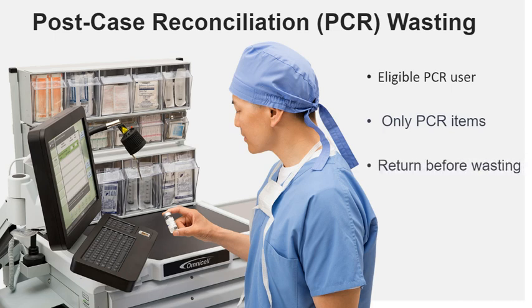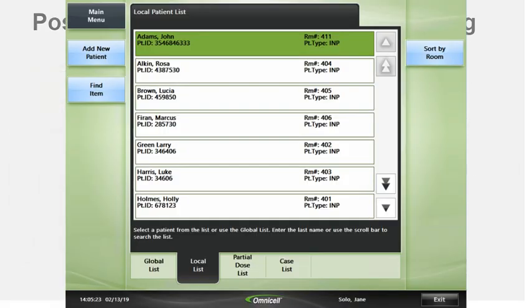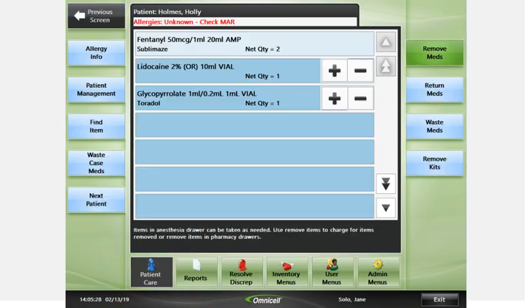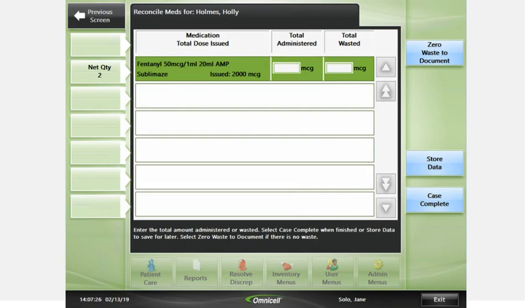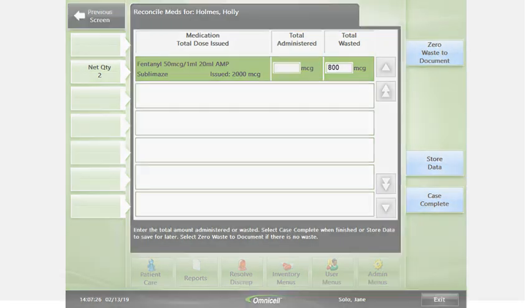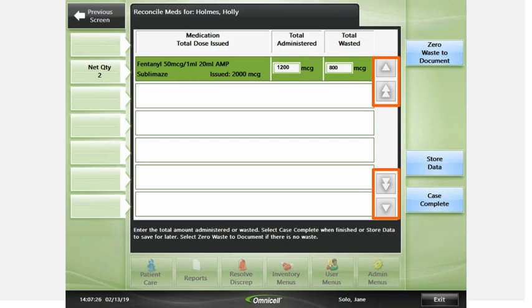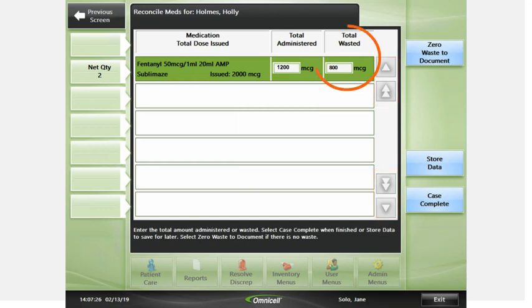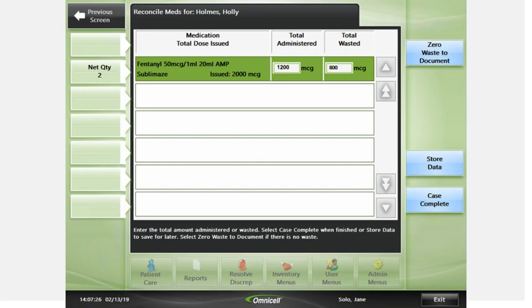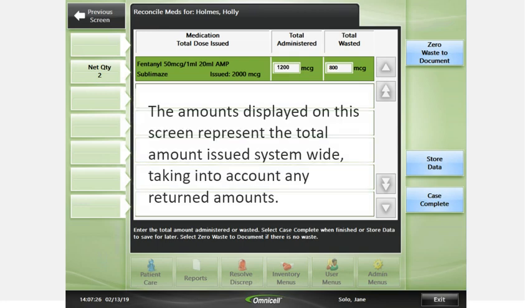Always return items before you perform a waste. From patient care, select the patient and press Waste Case Meds. From the post-case reconciliation screen, enter the total amount administered or wasted. Press the up-down arrows or the tab key on the keyboard to advance quickly through the list. The remaining amount is calculated automatically based on the amount entered. The net quantity removed is shown on the left of the screen. The amounts displayed represent the total amount issued system-wide, taking into account any returned amounts.